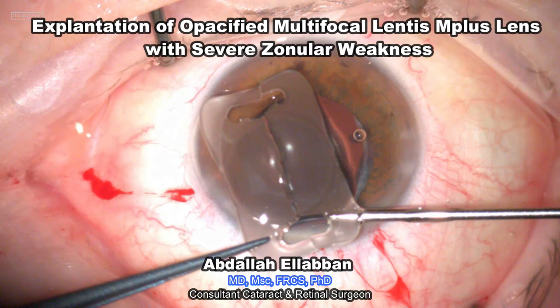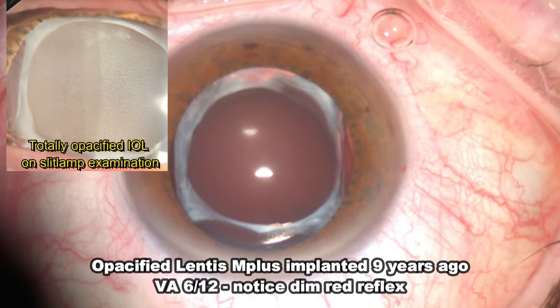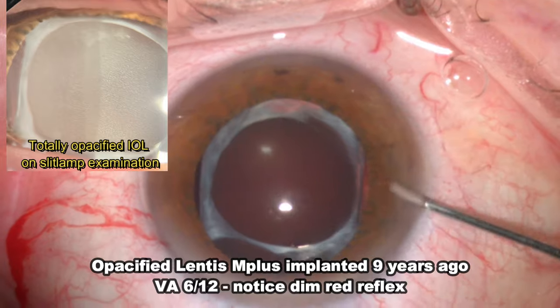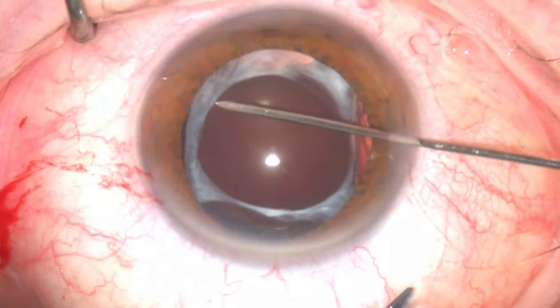Explantation of opacified M-Plus lens with severe zonular weakness. This patient had an opacified lens implanted nine years ago. The lens was totally opacified on slit lamp examination, and vision gradually deteriorated to 6 over 12.